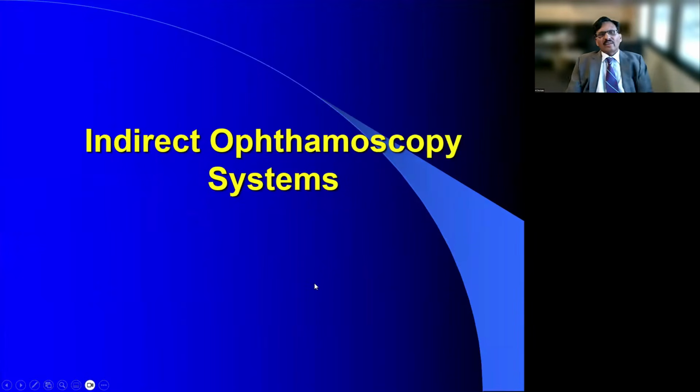So beyond the direct ophthalmoscopy systems, which do not require any inversion of the microscope, sometimes this is relevant in surgeries you do in camps or in areas where technically things are not really available. The direct system is extremely easy to carry, does not need an inversion, and you can carry out at least the work in the posterior pole if that is a pathology that you're trying to address.